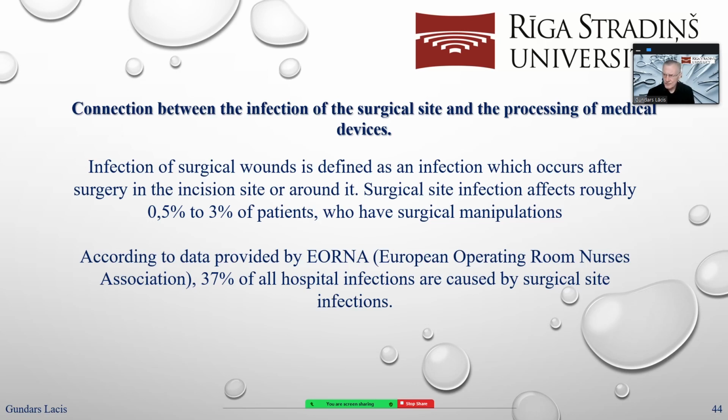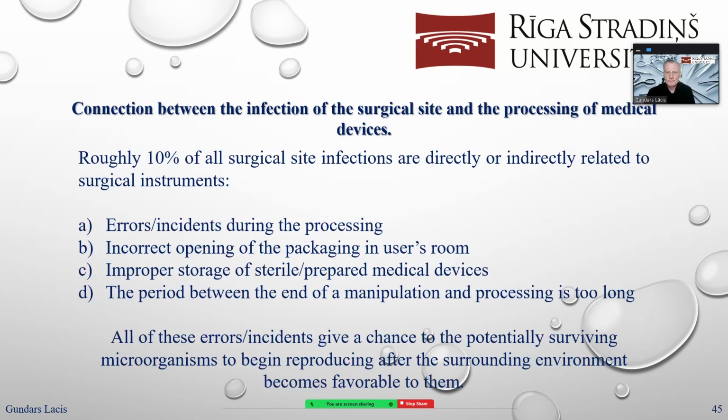The World Health Organization says instruments are involved in approximately 0.5 to 1.5% of all surgical site infections. But in reality, the opinion is that it's approximately 10%.